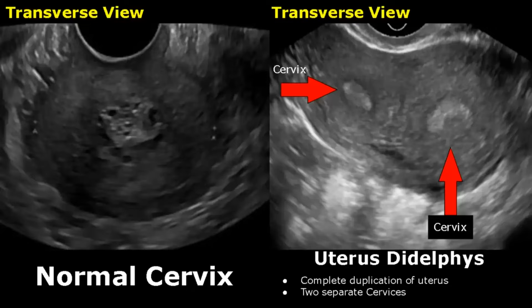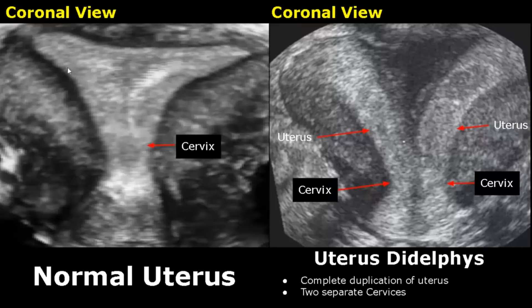These are 3D reconstructed coronal images of the uterus — this view is best for diagnosing congenital uterine malformations. This is how a normal uterus looks in a coronal 3D ultrasound image, and here we have two separate uteri showing complete duplication of the uterus and cervix.